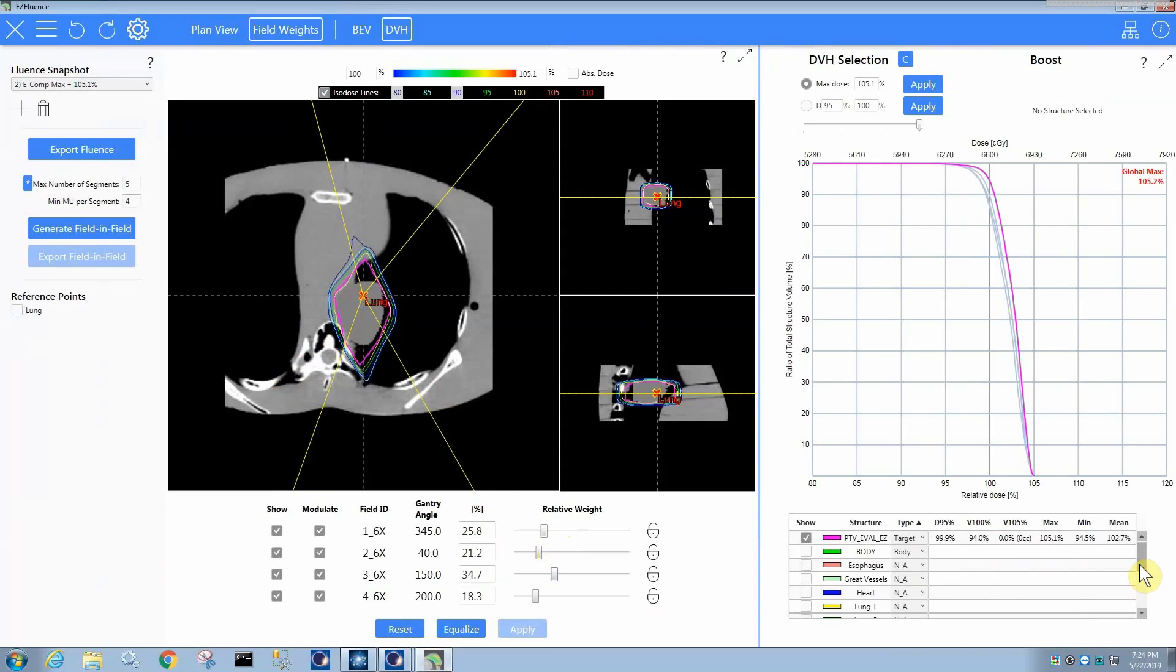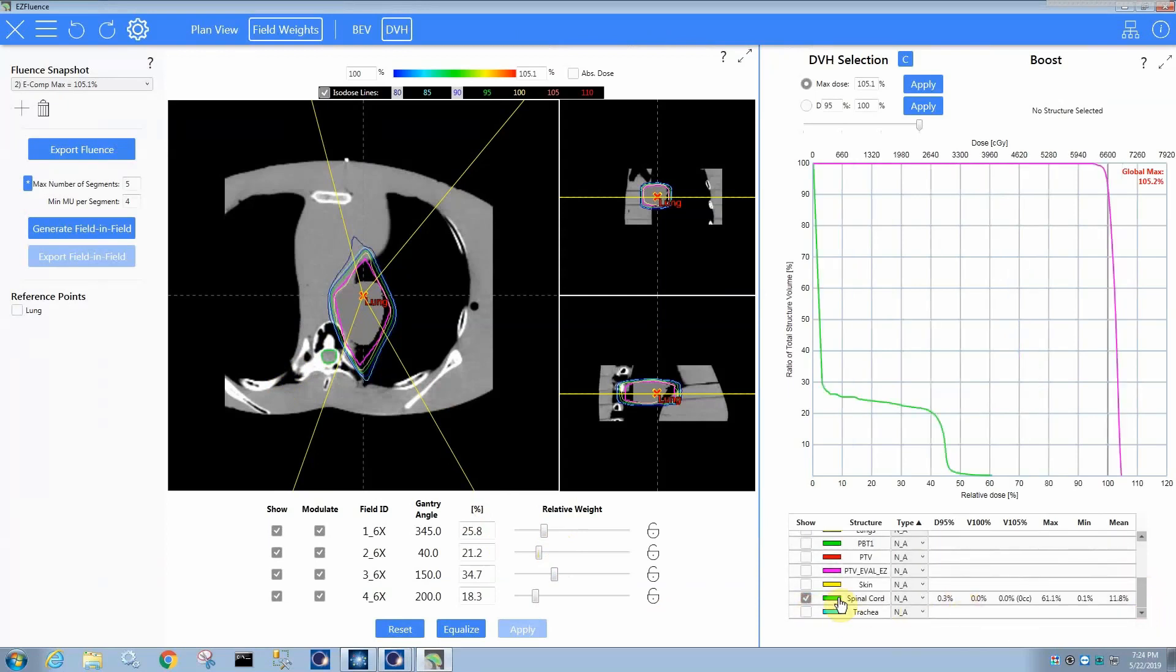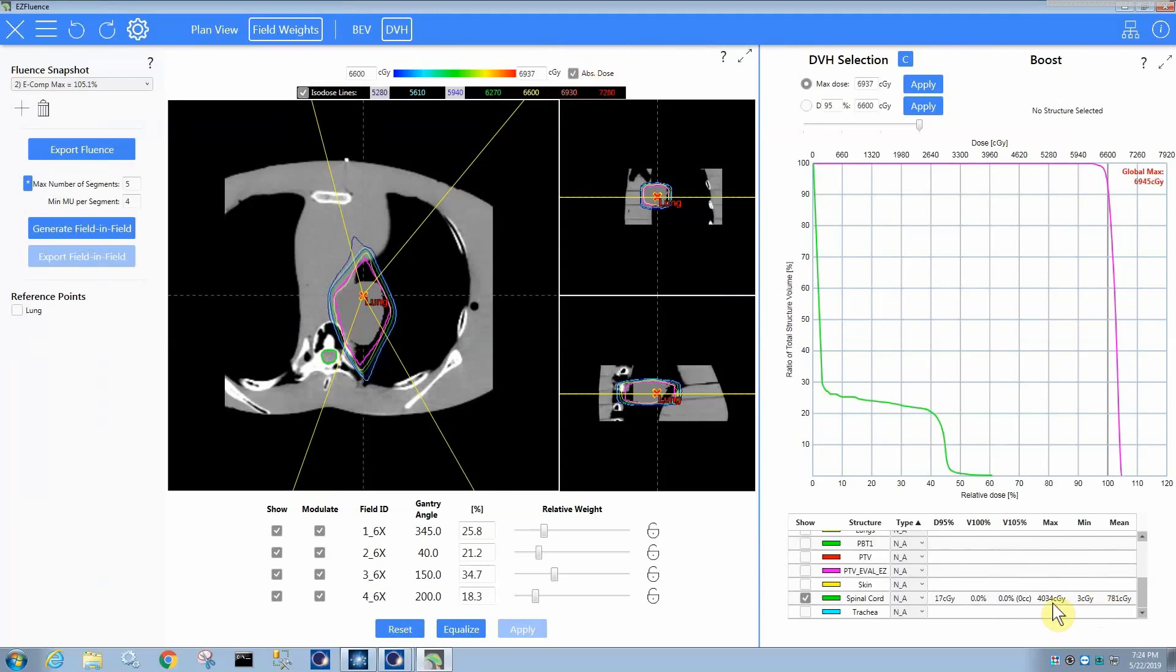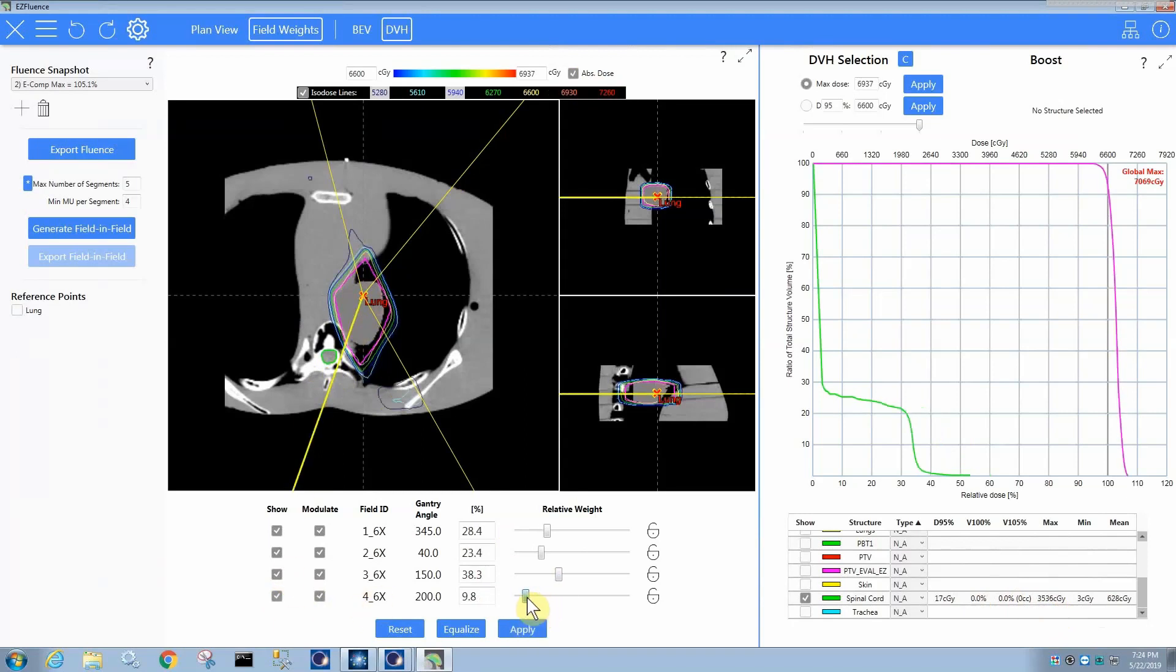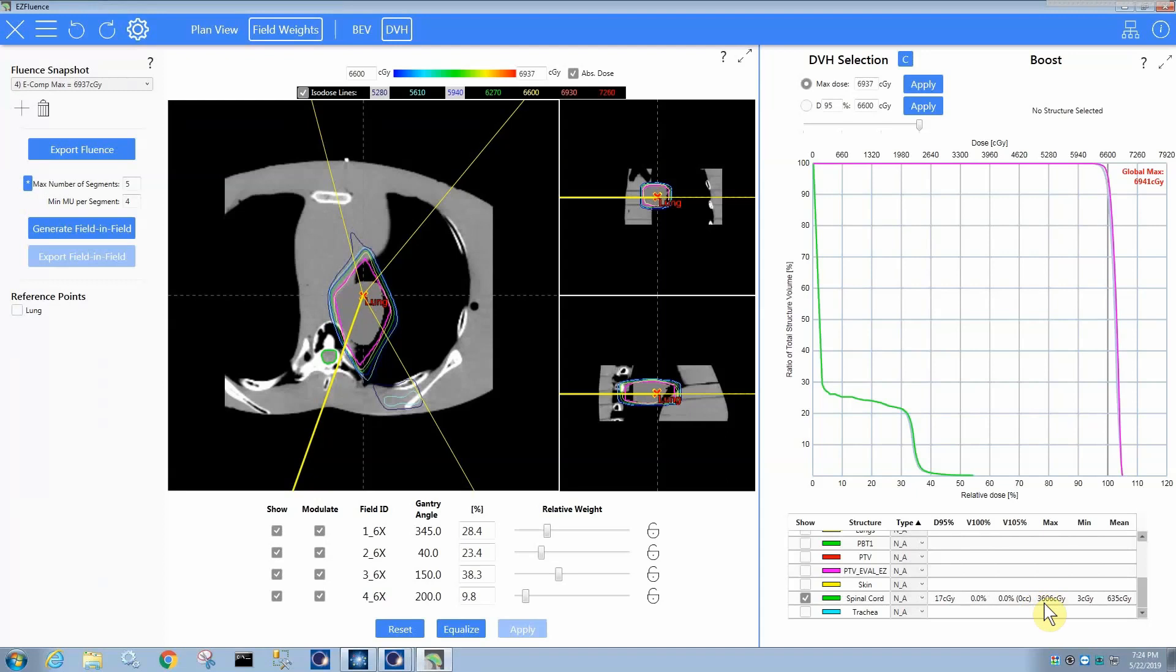Now, suppose you have a structure you really don't want to get a lot of dose to and you want to limit the max dose to like a spinal cord. So here I can change the dose view to absolute dose. And the max dose is 4,034. So that's not too bad, but suppose you wanted to control it even more. So you can find which field is going through it. So that's this last field here. Let's say you wanted to give it less dose. You can see it updating on the fly to approximately 3,500. When I hit apply, it actually does the full fluence optimization. It doesn't take very long generally. And after doing the full optimization, it's pretty close to what that estimated change was going to be. It's 3,600. Of course, you can see now that you have more dose coming in from this field. And so that might not be what you want, obviously.